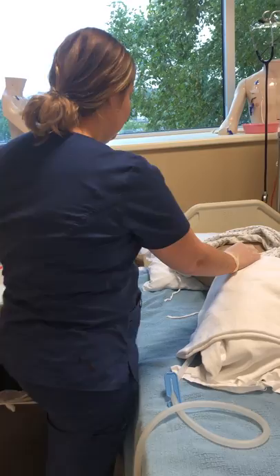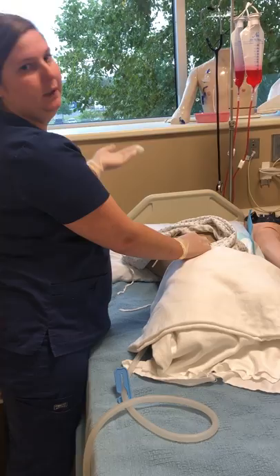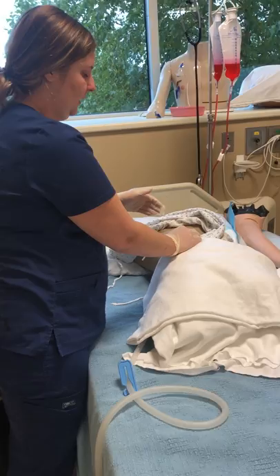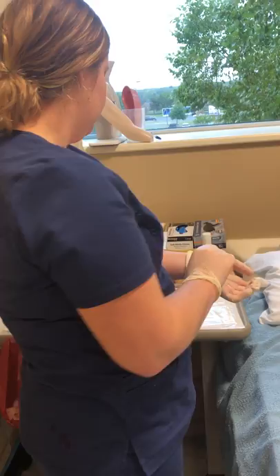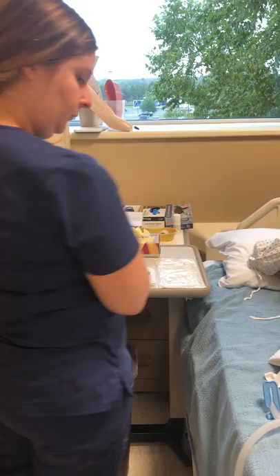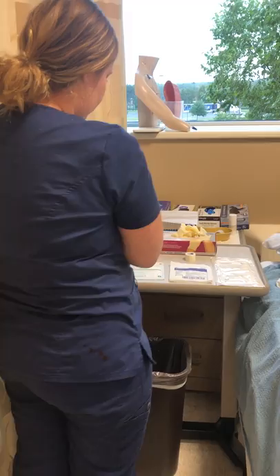Then I'm going to assess the wound itself for any redness, edema, ecchymosis, again drainage, and the approximation of the wound, if it has any changes. I would also feel around for any crepitus or subcutaneous emphysema. When I'm done with that, I'm going to remove my gloves, wash my hands again, and put on another pair of clean gloves.